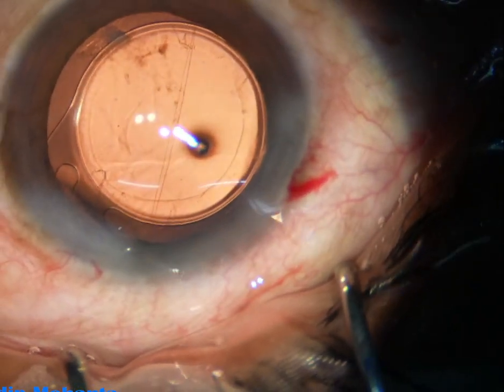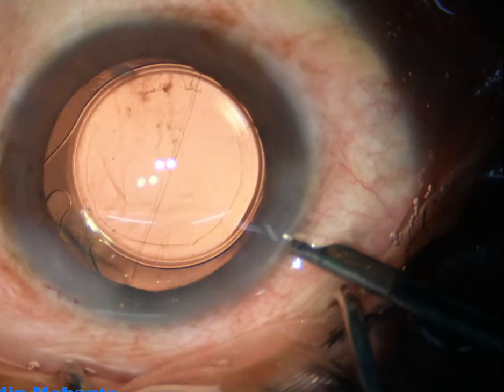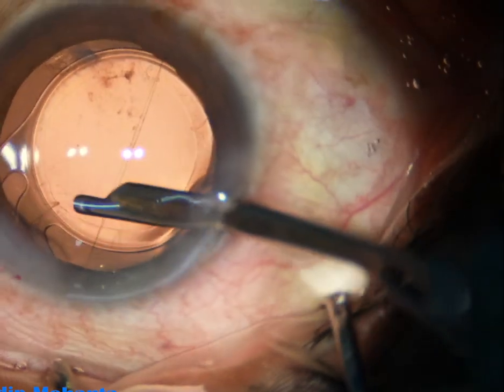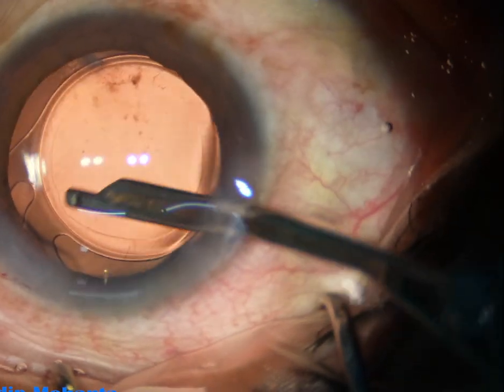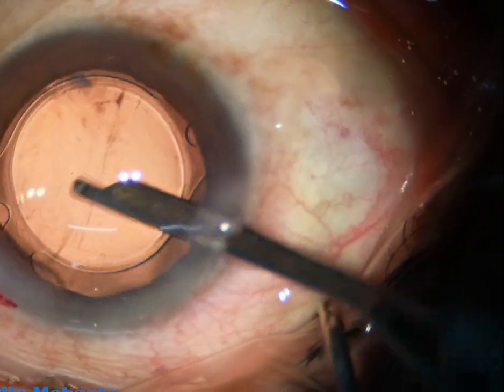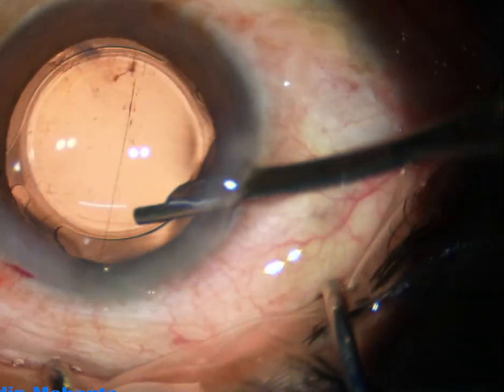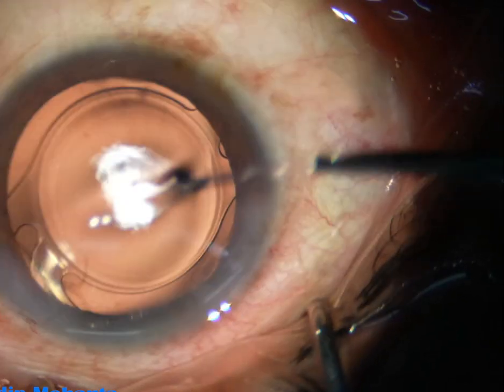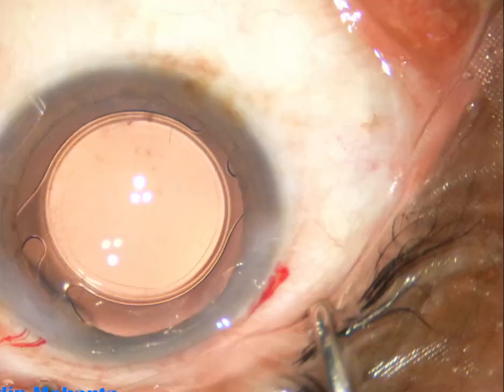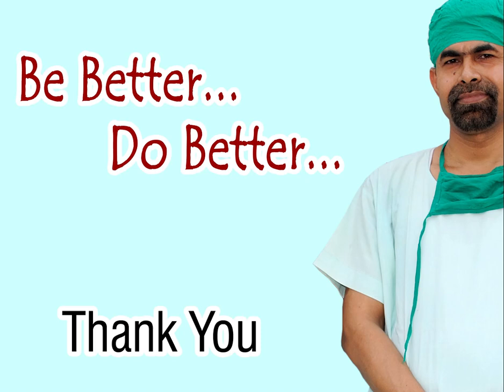The side port is closed by hydrating the corneal stroma. Now a final lavage of the anterior chamber is performed. Whatever viscoelastic sticks to the corneal endothelium is removed at this time. The anterior chamber is thoroughly lavaged, any cortical fiber anywhere is removed, the anterior chamber is formed nicely, integrity of all wounds is checked, and the case is concluded.